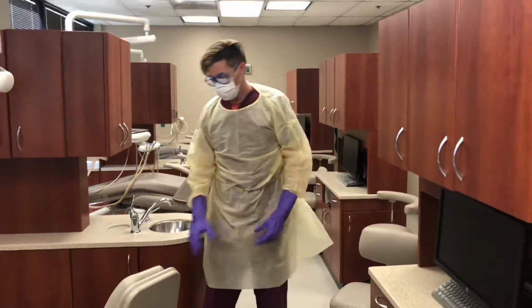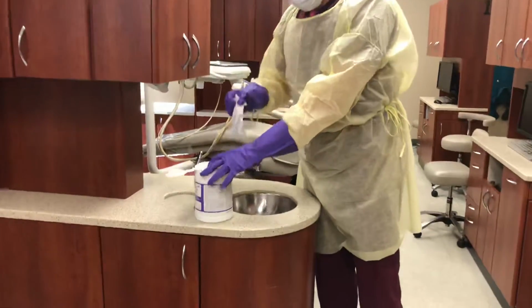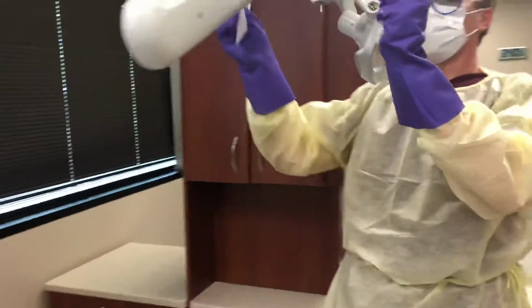Retrieve Virex disinfectant wipes from unit cabinet, then clean the following surfaces, throwing away often. Light handles, switch and arm. Do not wipe light shield. It will cloud the plastic.